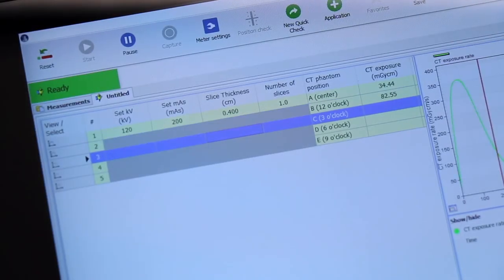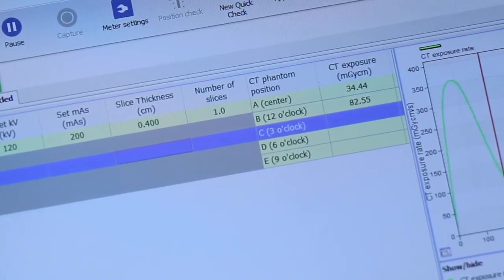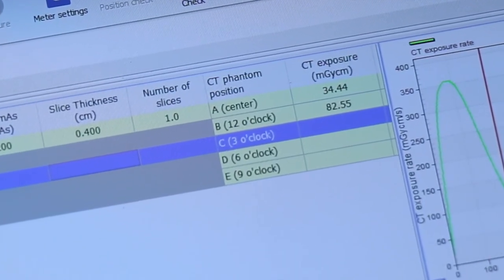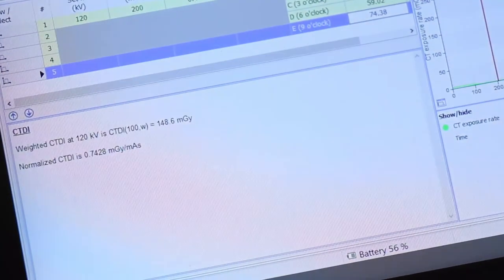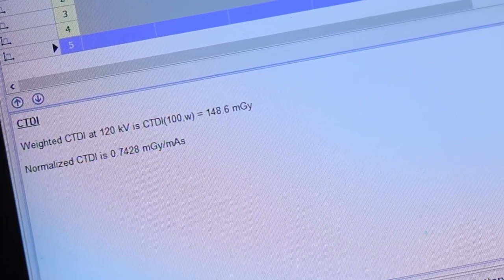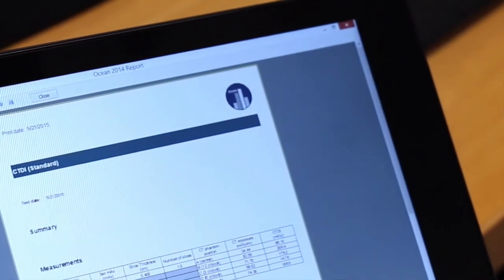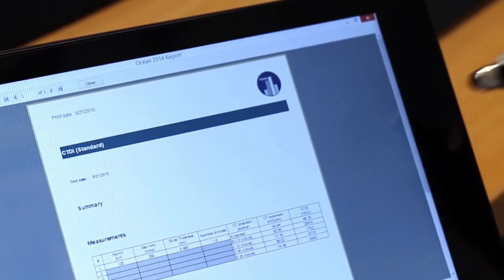Ocean guides you step by step through your whole measuring session. After completion of the measurements, weighted CT-DI is presented as well as normalised CT-DI. When you are finished, just tap print and your report is created and ready to be printed.